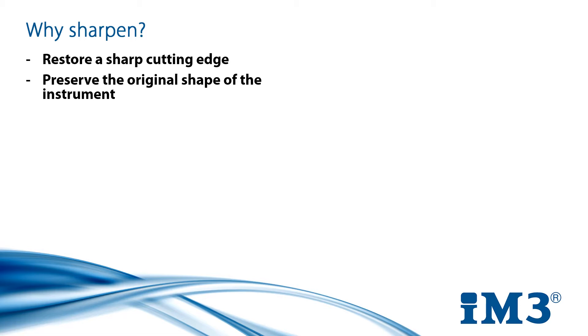Each instrument is designed a certain way for a reason, and altering this shape can impact how the instrument does its job. A blunt instrument can also cause clinician fatigue, as they work harder to remove deposits within the mouth. A sharp edge will cleanly slip under a deposit to lift it from the tooth, something a blunt edge is too rounded to do.